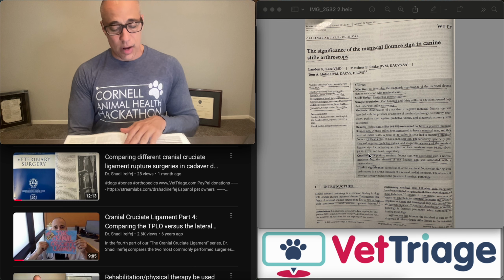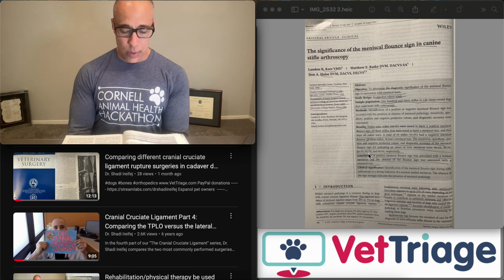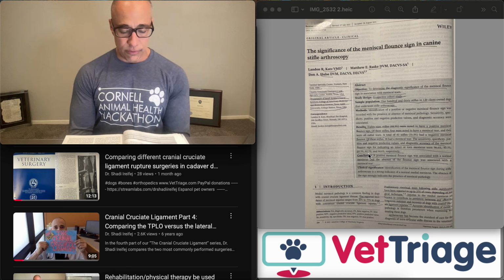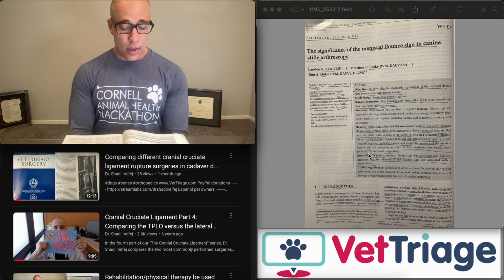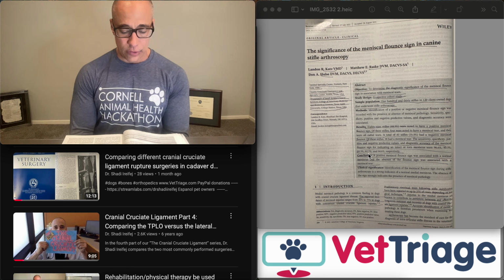Meniscal flounce sign was positive in 68.5% of stifles. Normal menisci were noted in 85 of the 89 stifles. The meniscal flounce sign was negative in 41 stifles. Meniscal tears were noted in 38 of those 41. So a total of 42 stifles, or 32.3%, had meniscal tears.